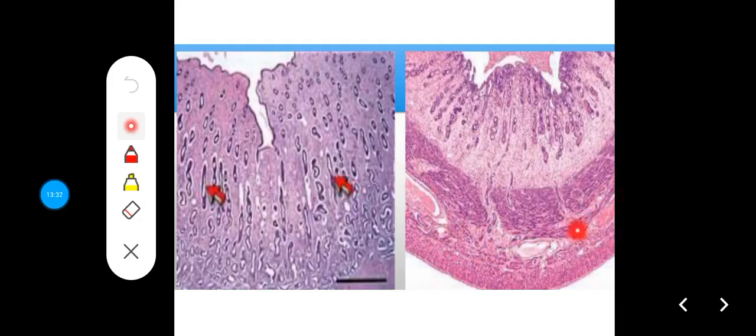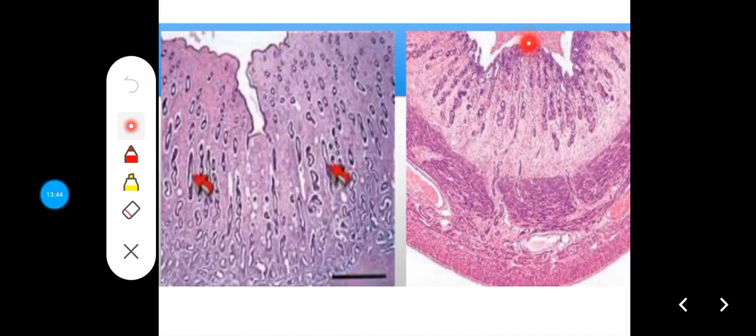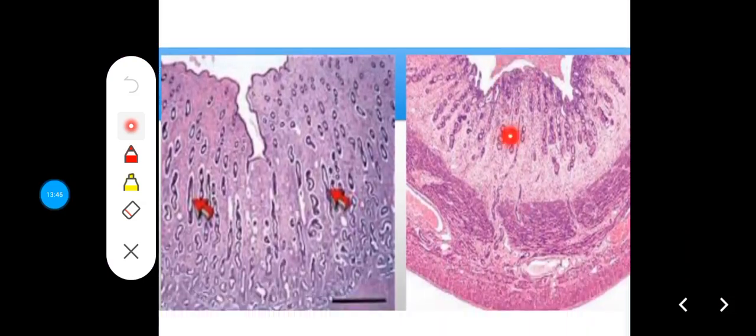So the muscle layer is thick. It also contains blood vessels. So if you zoom in, you see some circular spaces, which represent blood vessels. Then notice the way that the uterine glands are aligned in one direction, and then they appear kind of tortuous here, which represents that the uterus is in the secretory phase. And then the glands extend deep into the basal layer of the mucosa.